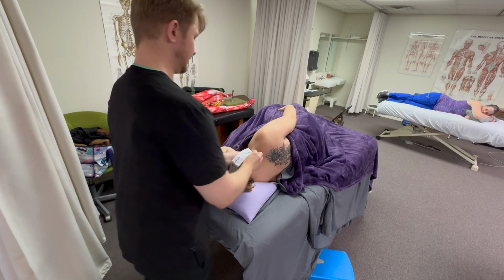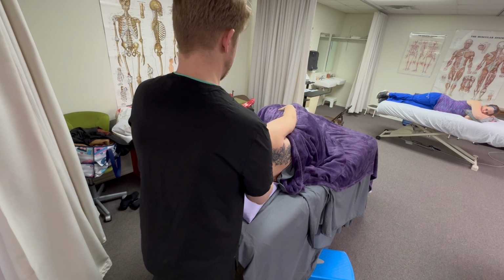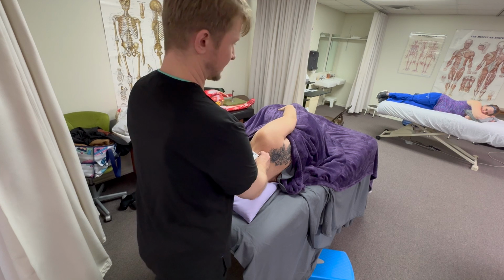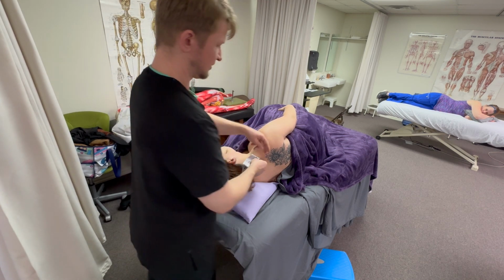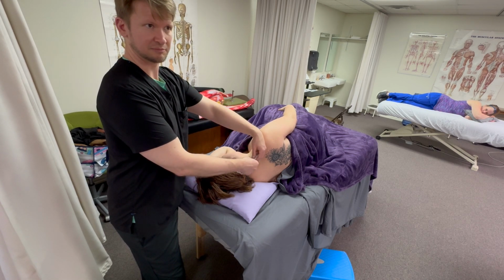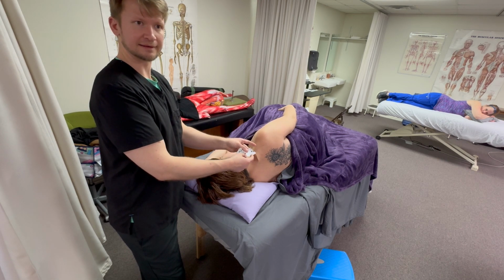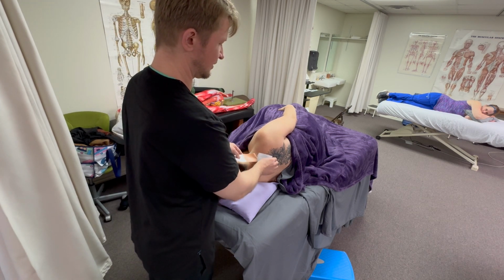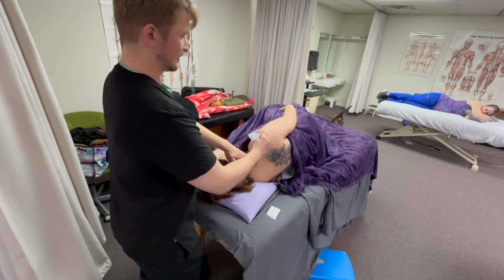So I go right here. Boom. Pull that one down. As I pull it down, a lot of times it'll just stick. So like that. Make sure the anchor is good and set. Even right now, I could start tearing this beforehand to make it easier. If I forgot to tear this, I could just tear it all right there. Gonna take the backing off. I'm trying to think upper trapezius.